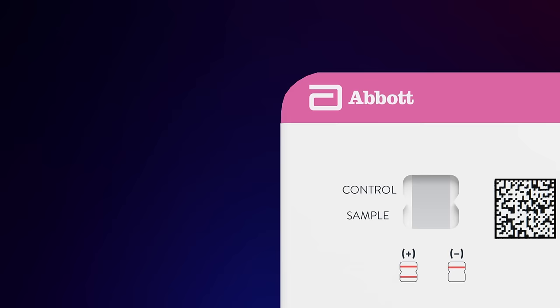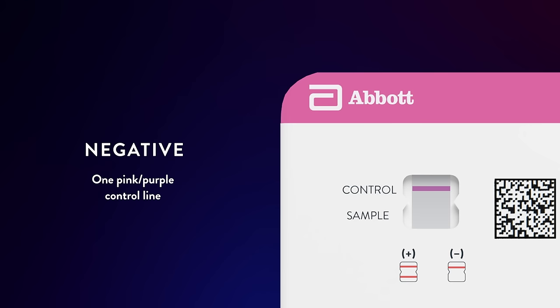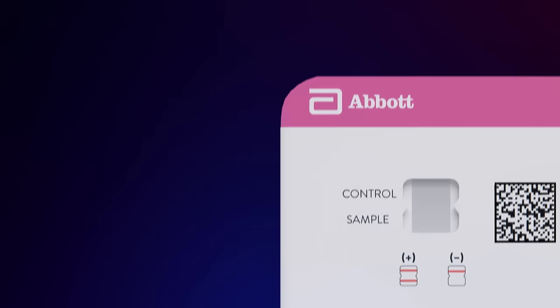A negative result will have only one pink or purple line on the top half of the results window, where it says control. This means that COVID-19 was not detected.